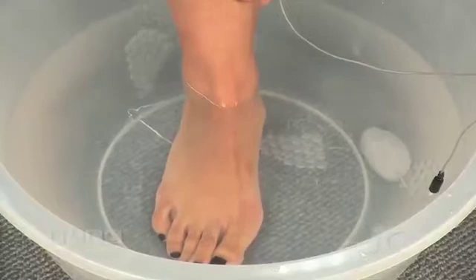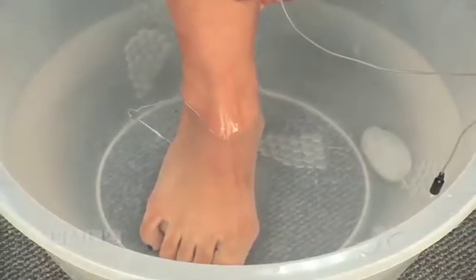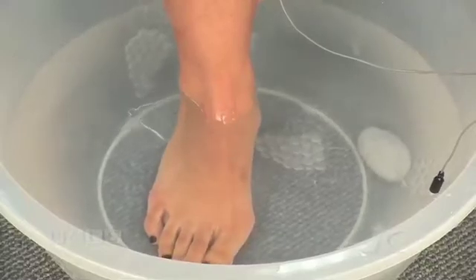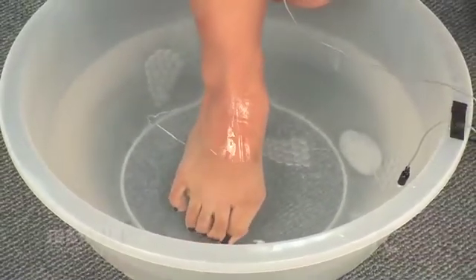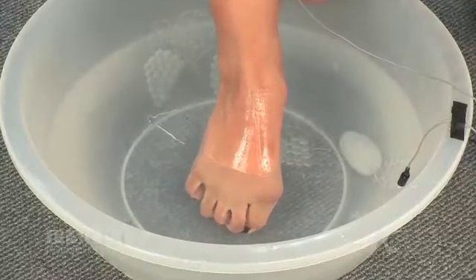Please note that once the electrode has been submerged, the conductive and adhesive gel will float off of the electrode. The electrode can be used again for submersion, but it cannot be used for stimulation directly on the patient's skin.